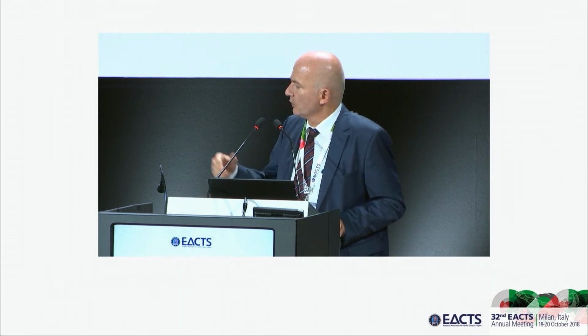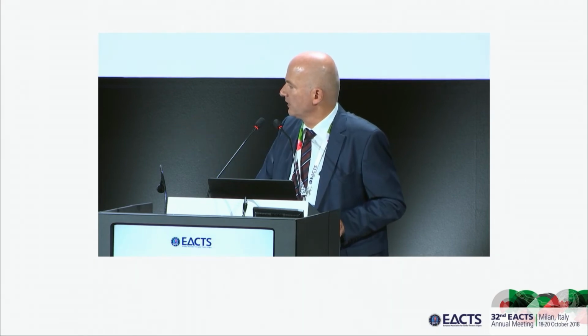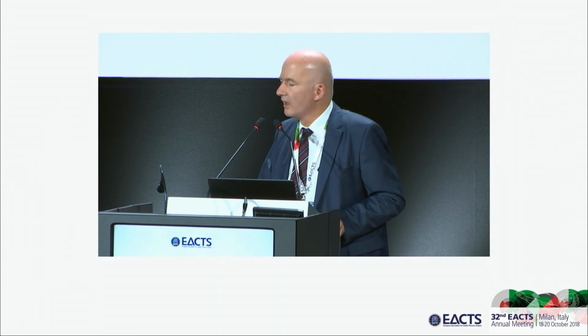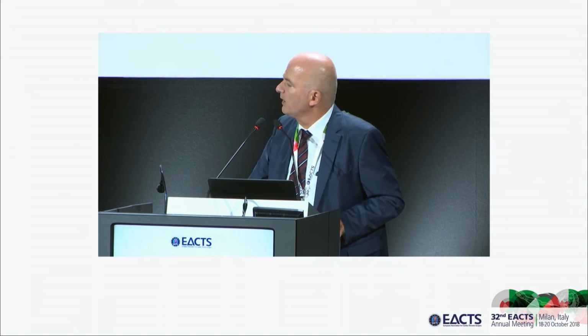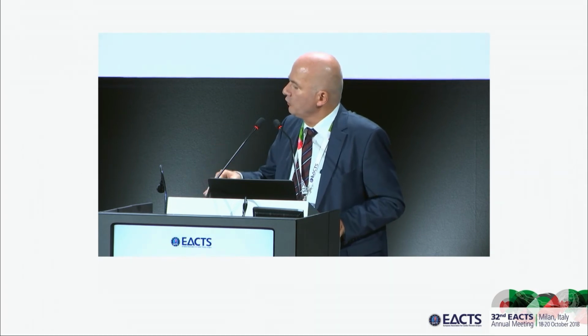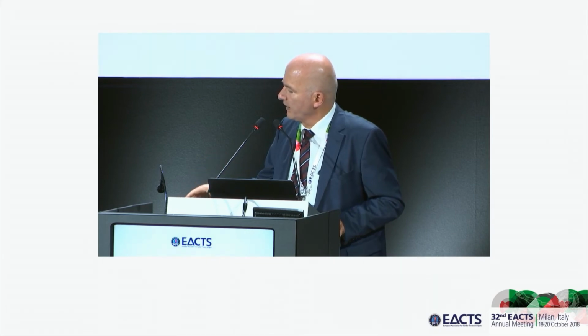So Joe, you would probably go home with a 25 millimeter annuloplasty if you needed one. Dr. Kunihara here from my team, who's smaller, would maybe go home with a 23 millimeter. Then I do my valve repair, and the annuloplasty is not in the way of the valve repair. Okay. Any other question?